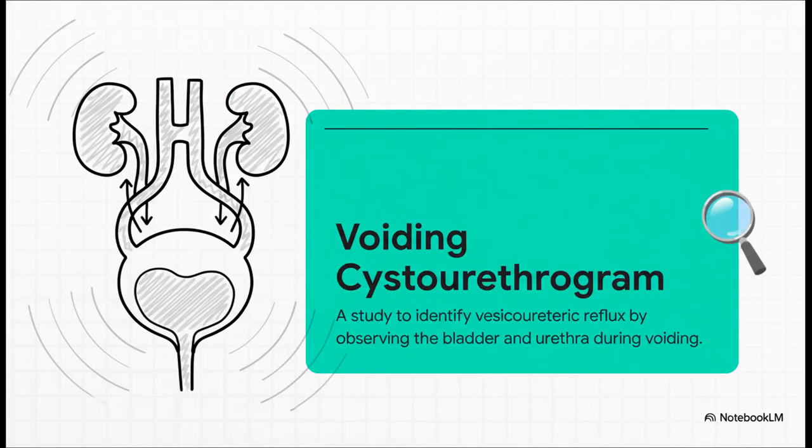All right, next up is the VCU. A bit of a mouthful, I know. This one's a big deal, especially for children who keep getting infections. A tiny tube is used to fill the bladder with a special dye that shows up on x-rays. Then they basically take an x-ray movie while the person is having a wee. And what are they looking for? They're checking to see if any of that dye goes the wrong way, back up towards the kidneys. That backward flow is called reflux, and it can be the root cause of a lot of trouble.